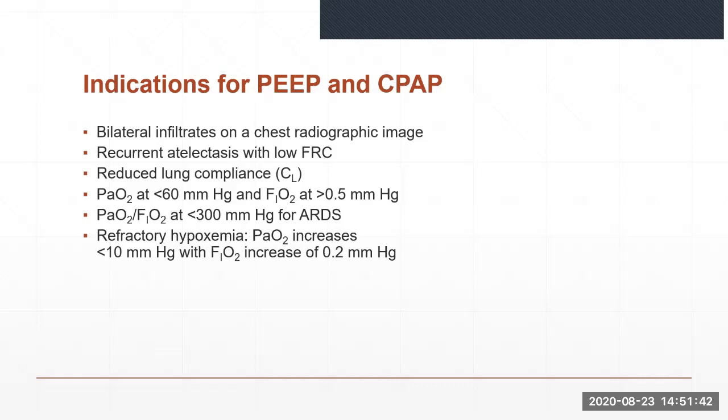Once a patient's clinical condition indicates that PEEP or CPAP therapy is warranted, it is prudent to initiate this form of therapy as soon as possible. High peak pressures, greater than 35 centimeters of water pressure, along with FiO2 values of 0.5 or greater, may damage alveolar cells type 1 and 2 in less than 24 hours. Therefore, CPAP or PEEP should be initiated early in the course of therapy to avoid lung damage from high pressures, volumes, and FiO2.